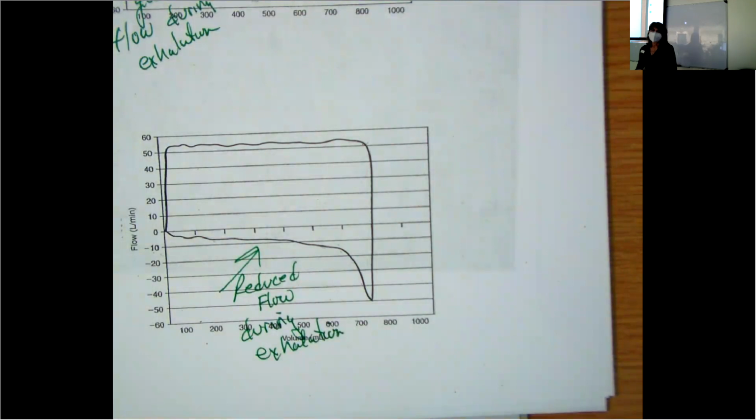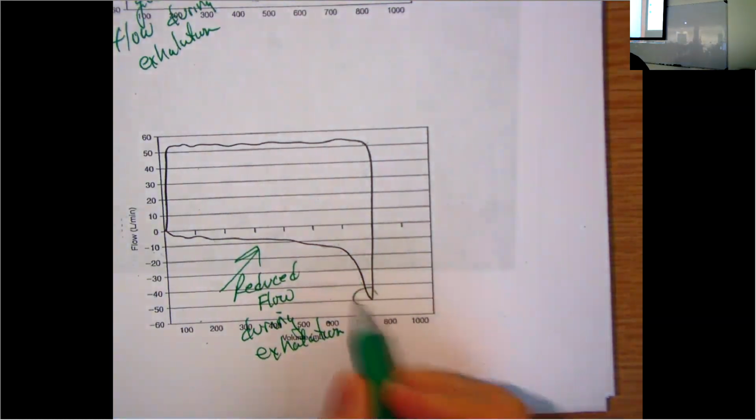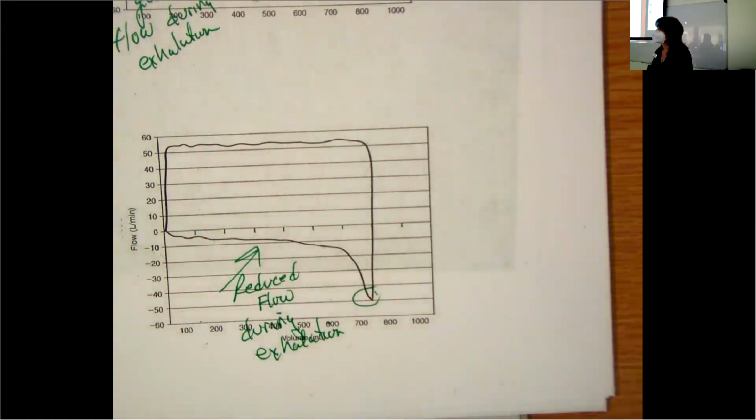Would this also be due to like a low compliance valve? No. No, low compliant lungs, the lungs empty very easily. They're stiff, they're hard to inflate, but boy, do they empty easily. There's a fast exhalation. Yeah, so initially, there's some good flow.